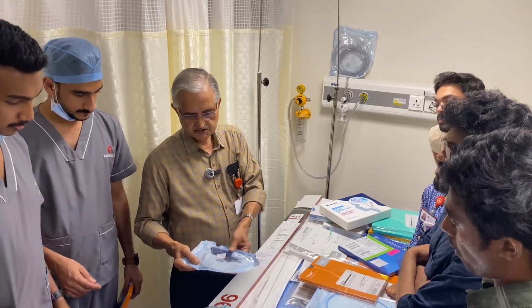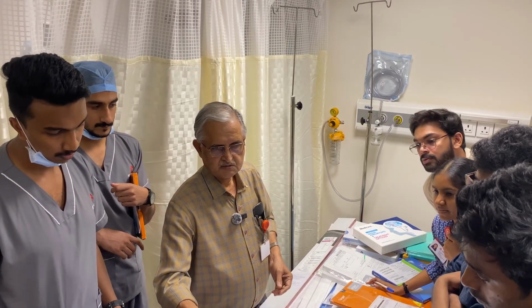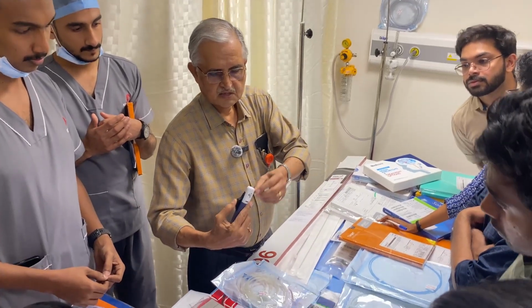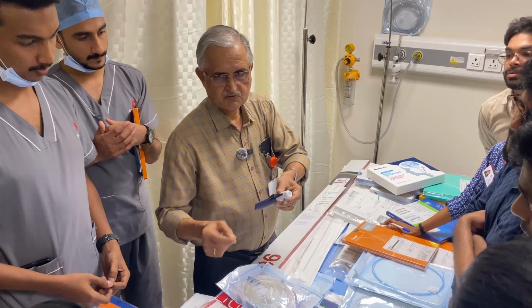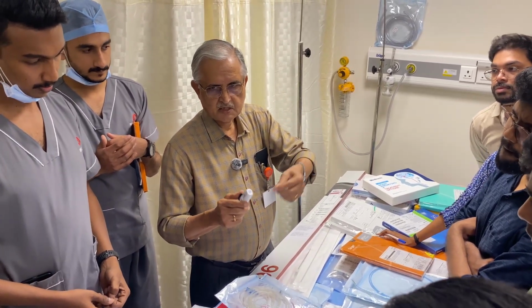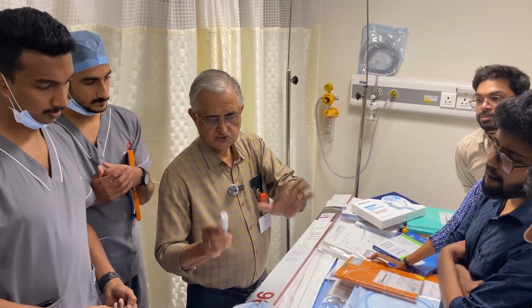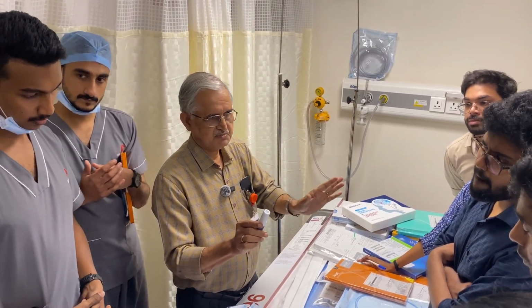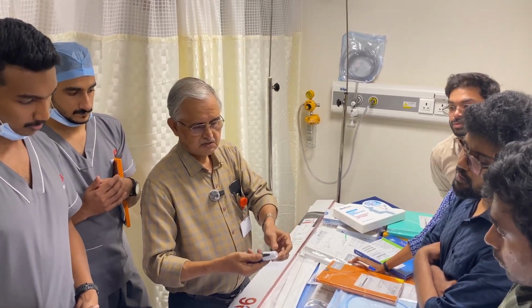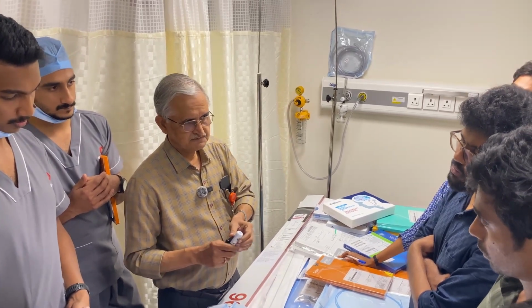This is the detachment device. There is a space inside it, and inside that is the pusher wire of the coil. The pusher wire is attached to it. The coil will be attached until you deploy with this. It will be always retrievable. So once you are sure that the coil position inside the aneurysm is perfect, check with the angiogram, then you connect it here and give an electric pulse, and that will be detached there.